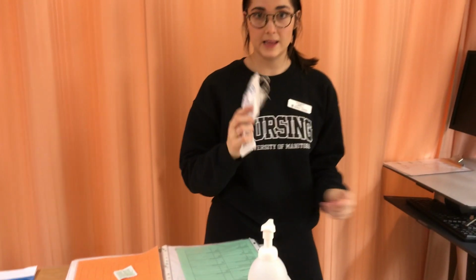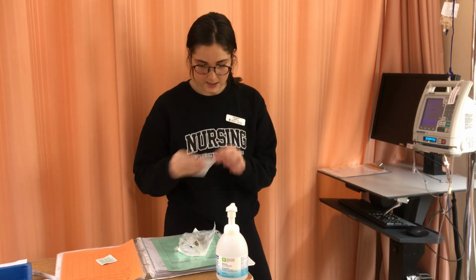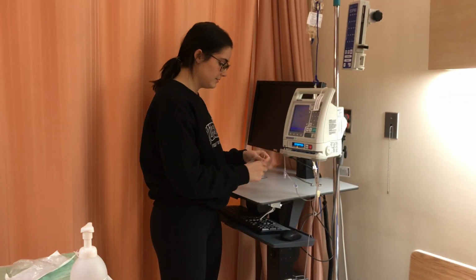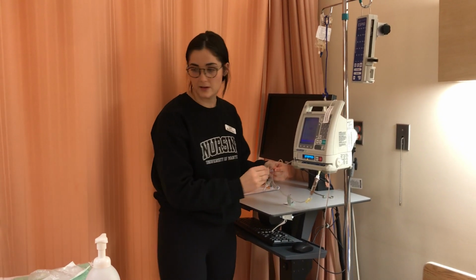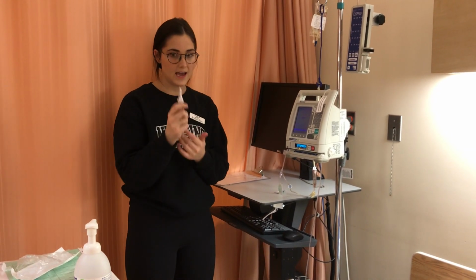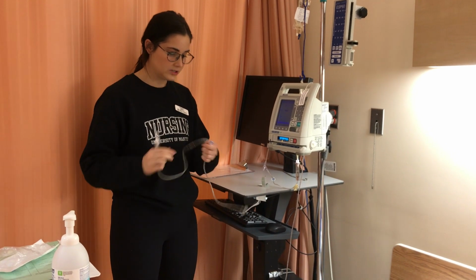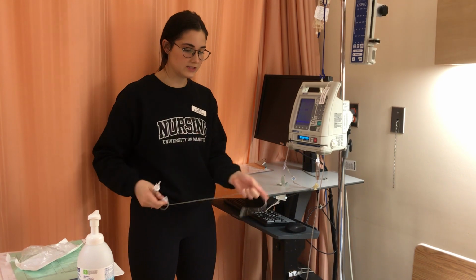And next I'm going to prime my line. So I have my secondary line with my name tag on it. So first I'm going to swab the port here for 30 seconds, and I'll let it dry for 15. The one right above the channel so that it infuses at the correct rate that I'll put on here. And this would have a cap on it to maintain sterility. And so would the bottom. So I'm going to clamp this and make sure it's closed.